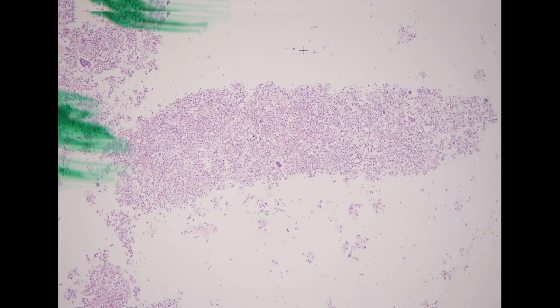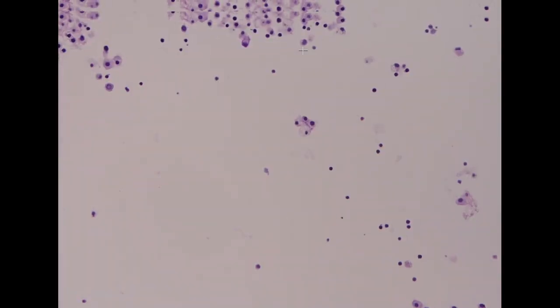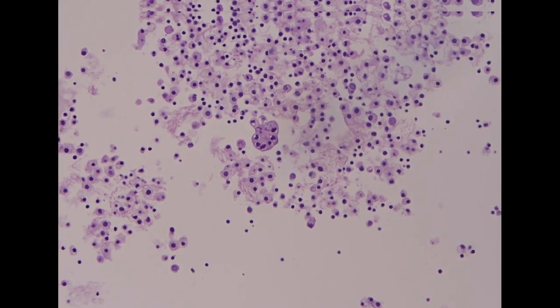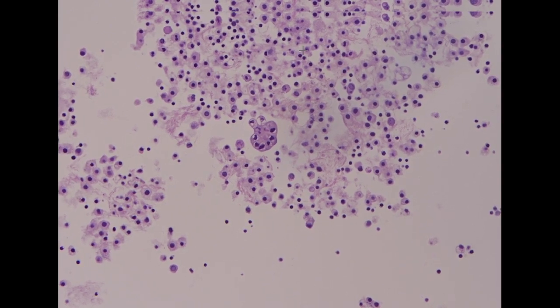However, just like I said, this is relatively unusual as the first presentation of the patient. Hence, the specimen shows very scant tumor cells in the cytospin preparation. The cell block seems to have more cells that we can see here.